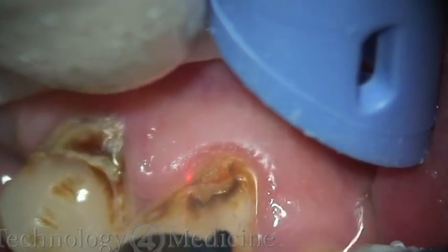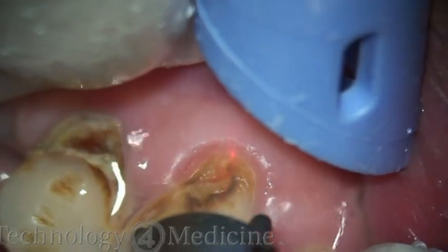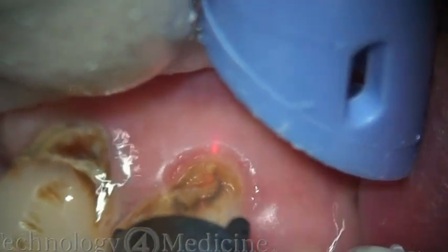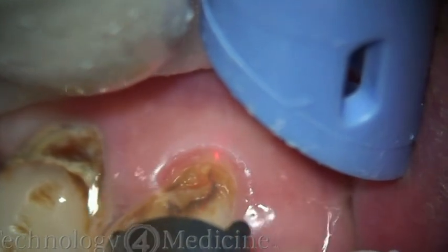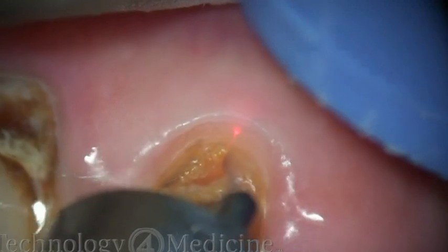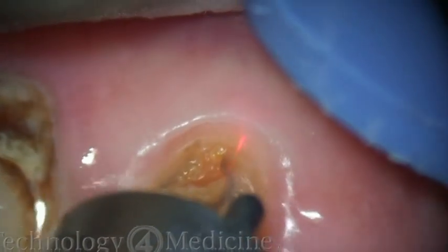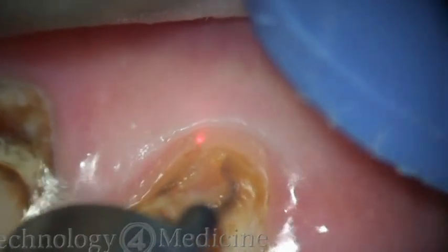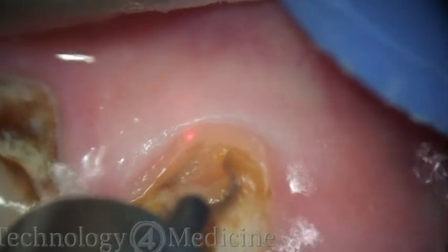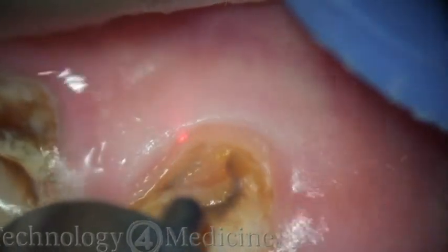One of the other advantages of the Erbium YAG PowerLase AT is the six variable digital pulse duration settings that the laser has. In this case, I'm using a 1000 microsecond pulse duration to expose the class V decay that I'm going to prepare here. You can see I'm doing a gingivoplasty and gingivectomy to create an area where I can work.